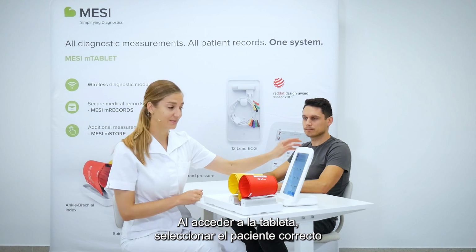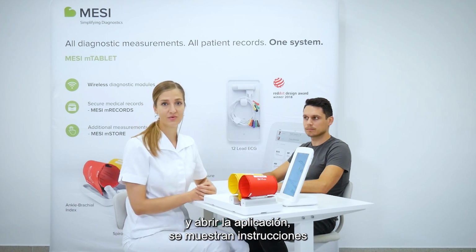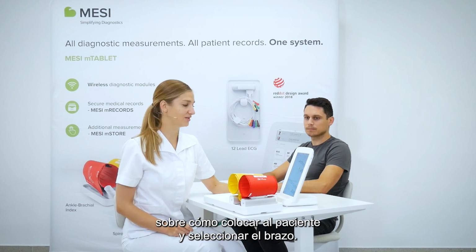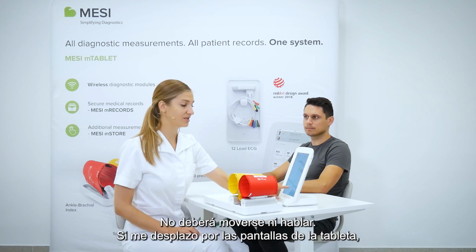Upon entering the tablet, selecting the correct patient, and opening the application, we get very clear instructions how the patient should be positioned and how to select the appropriate arm. So patients should sit comfortably, upright with a straight back, he shouldn't be moving and he shouldn't be talking.